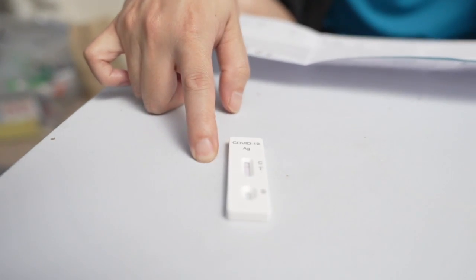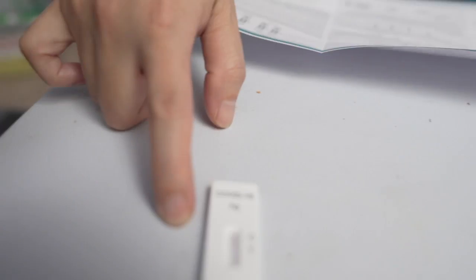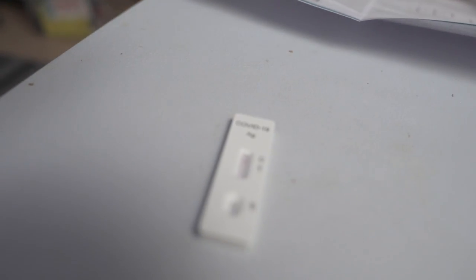Look, look, look. Oh, very disappointing. No T for COVID. Guess I don't have COVID. Yeah, no COVID.